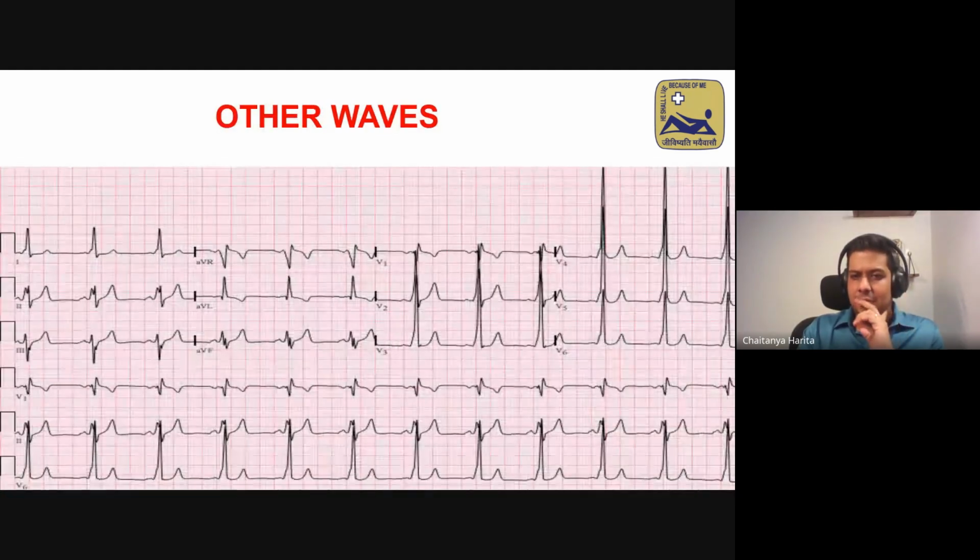One wave I want to bring out, which some of you may pick up in ECGs, and I was very impressed with, somebody from 2016, I'm not going to mention names, sent me an ECG of their patient. An absolutely normal ECG, came for fitness for cataract surgery. They sent me an ECG, put an arrow and said, "Sir, I think this patient has Wolff-Parkinson-White."